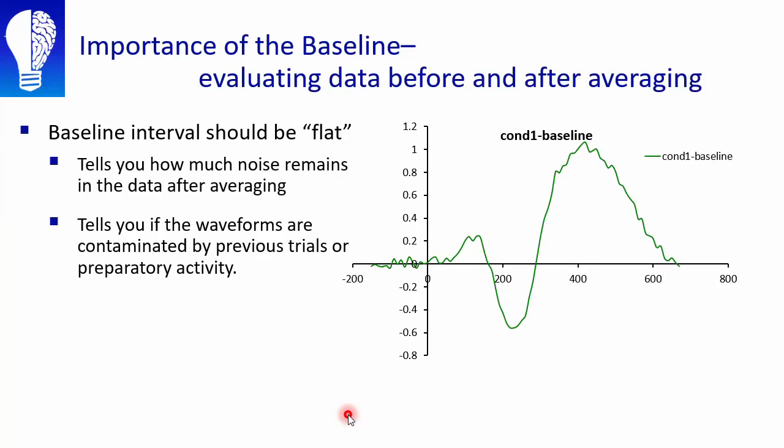One thing to keep in mind, particularly when you're evaluating your own data or reading articles, is to look at the baseline. If the baseline itself is pretty flat, then that's pretty good. If there are differences in the baseline across conditions, that would be a particular concern. Now, it may go up or down depending on what's happening right before that stimulus, so that could differ, and it could be okay depending on the situation, but it's something you want to look at and pay attention to, to see if there is a baseline issue with that particular paper.